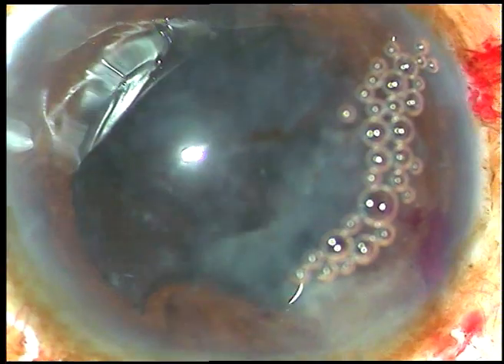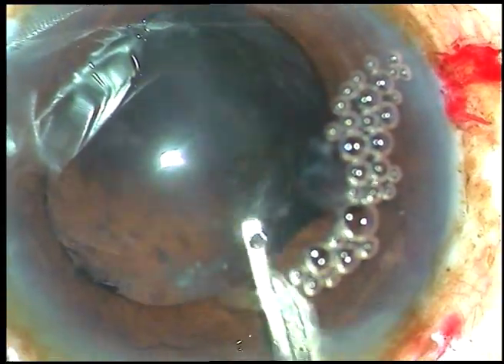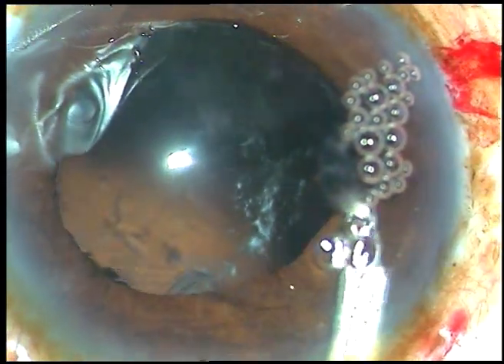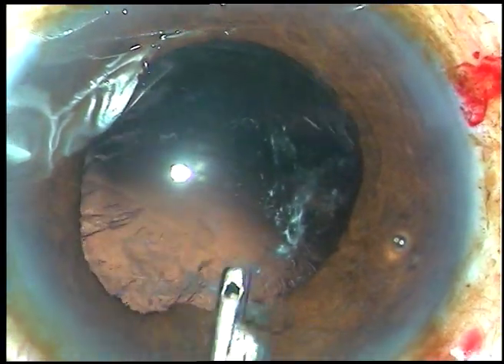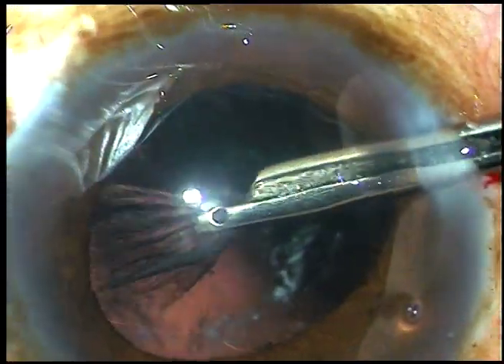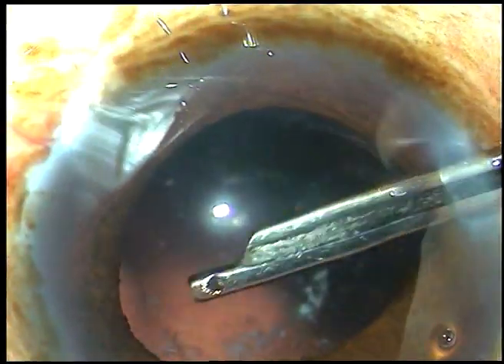Now the anterior chamber is irrigated with a Simco cannula using Ringer's lactate, and visibility improves. The epinucleus which was there in the anterior chamber comes out. Now I go through the side port at 8 o'clock and clean the cortical matter from 12 o'clock to 6 o'clock.